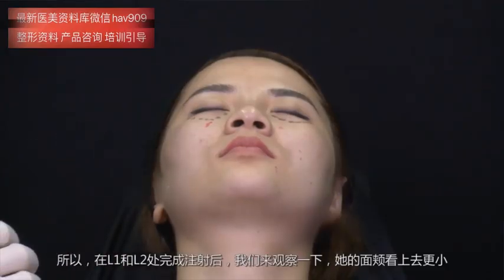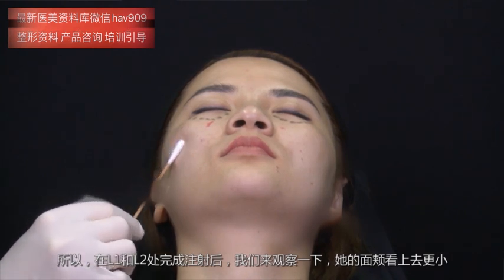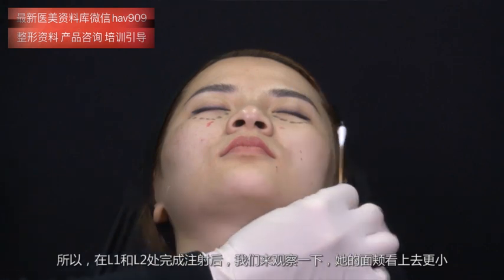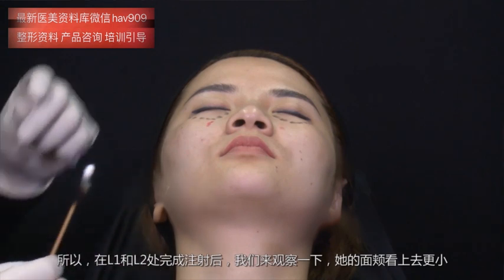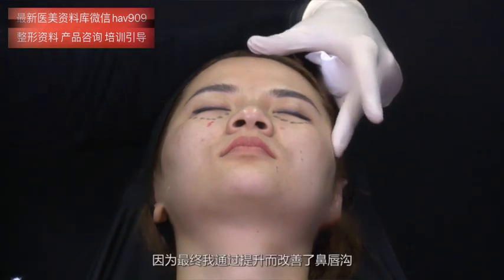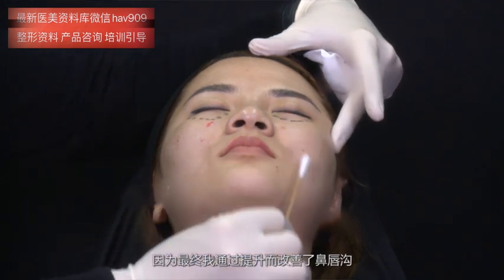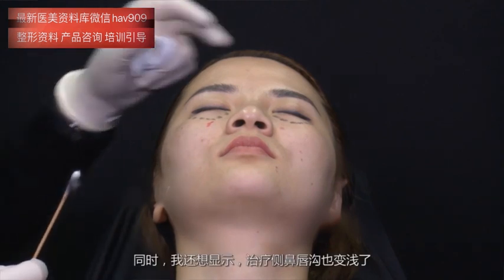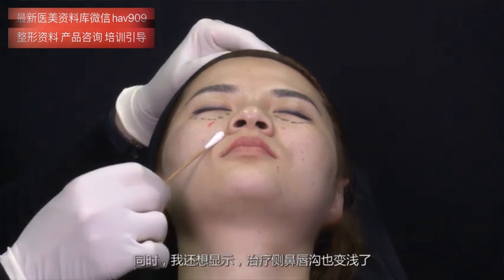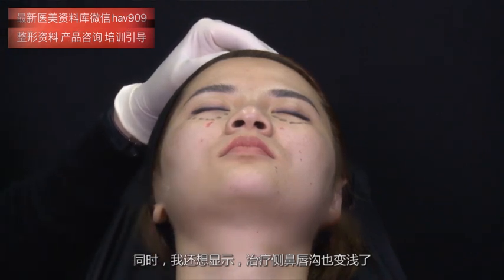So now, after injecting L1 and L2, please observe how smaller her cheek looks, because I ended up by lifting to improve the nasolabial fold. I would also like to show you how the nasolabial fold is less evident in the treated site.